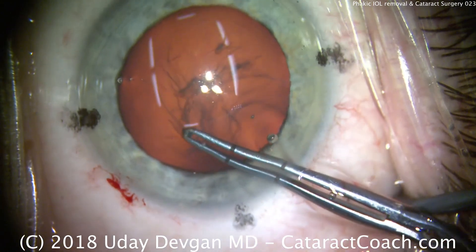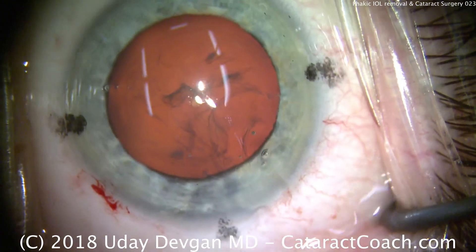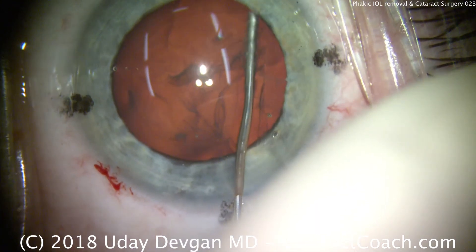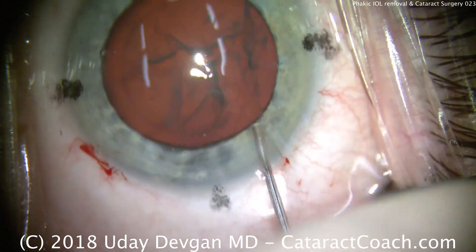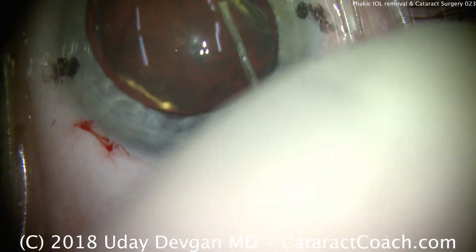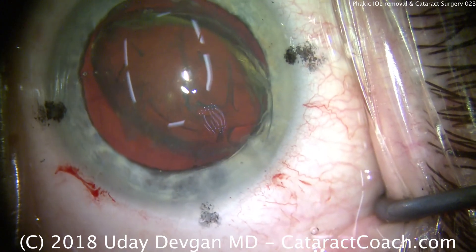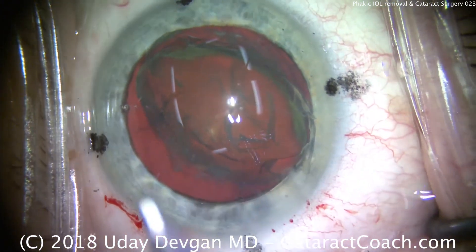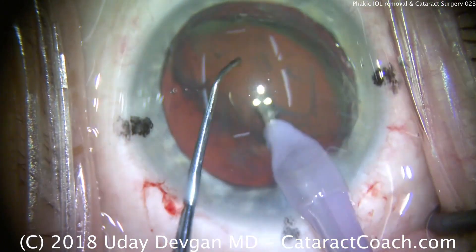We want that centered in the visual axis for the patient. At this point, we're going to do hydrodissection. It's a younger patient — only in his late 50s, young for cataracts — so the lens is relatively soft. We're going to hydrodissect it, maybe a little hydrodelineation. There's the delineation ring; we want the lens out of the capsular bag. It's a soft lens, so we're not going to need too much phaco energy. I'll put our phaco probe in here and have our chopper, and we should be able to remove this nucleus with very little phaco energy.